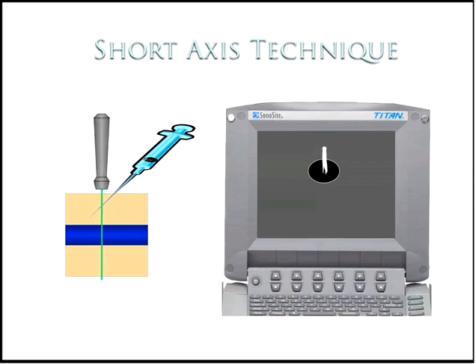As this diagram suggests, you can fan the transducer back over the needle in order to see the various aspects of the needle. Keep in mind that on the ultrasound screen, whether you're looking at the needle tip or any part of the shaft of the needle, the echogenic appearance will look the same.